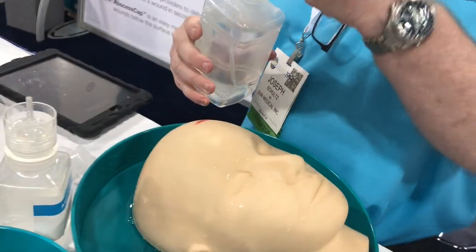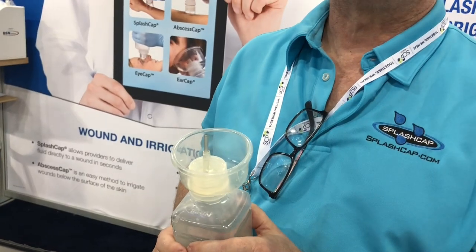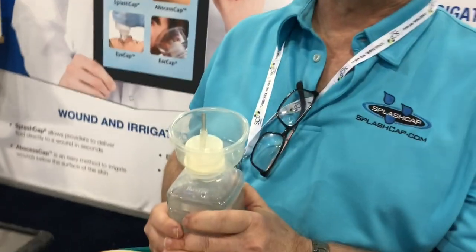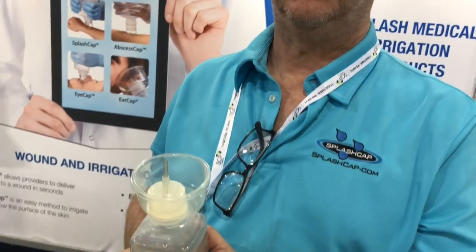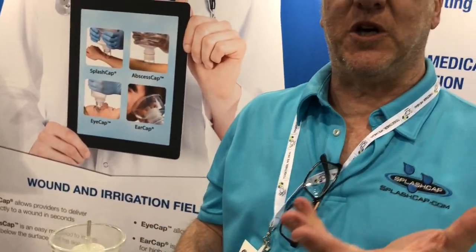There is the ear cap. Ear irrigation — I've used the one that screws on to the syringe that puts a spiral out and that doesn't work, and then you get out the thing from 1950 that puts a gallon of fluid in the ear in 10 seconds — the metal piston syringes. That's actually the basis of how I came up with this product, because those really large metal syringes seem to work the best since you're getting a lot of volume and turbulence into the ear canal.